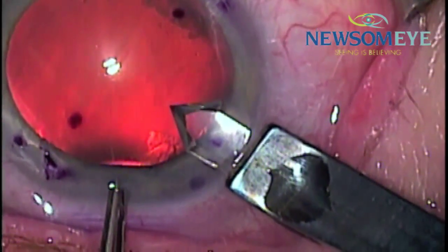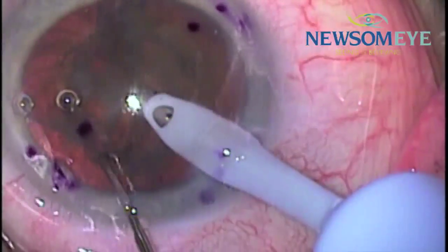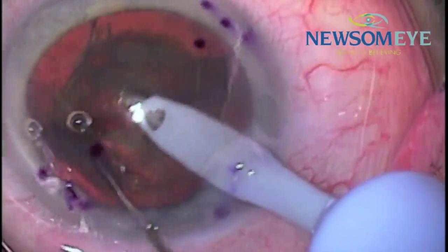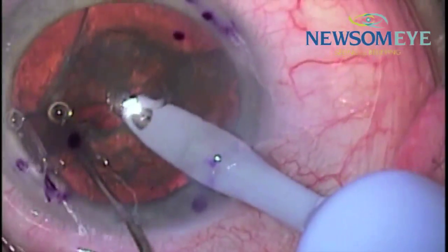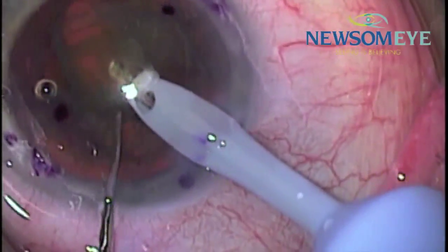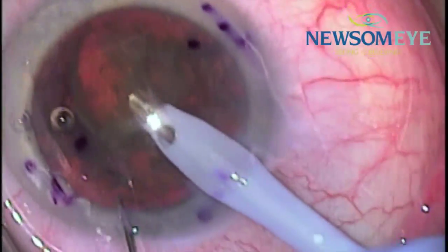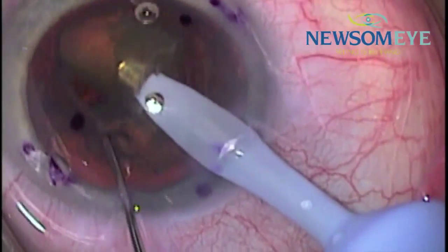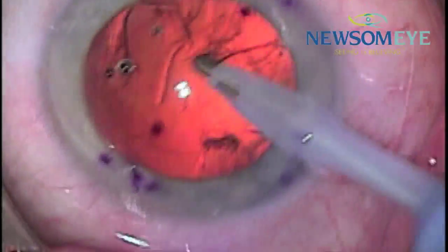We then make an incision into the eye. We use the phacoemulsification unit, which is like a small straw that sucks and vacuums the cataract, and we then remove the cataract.